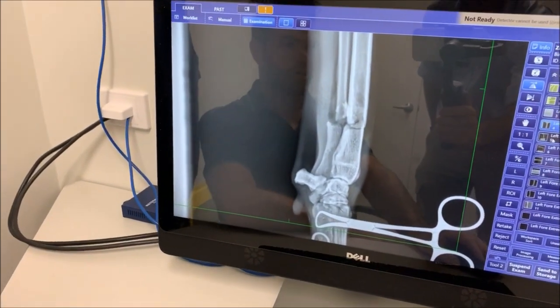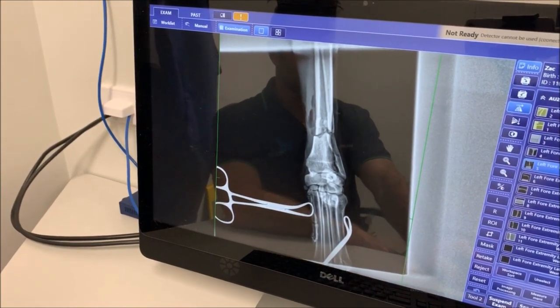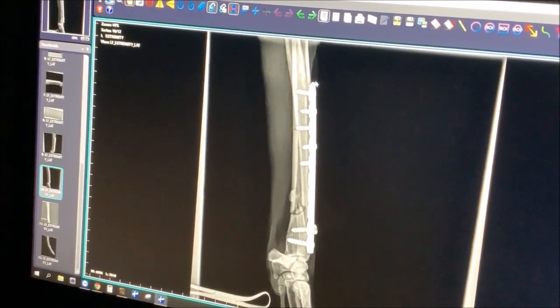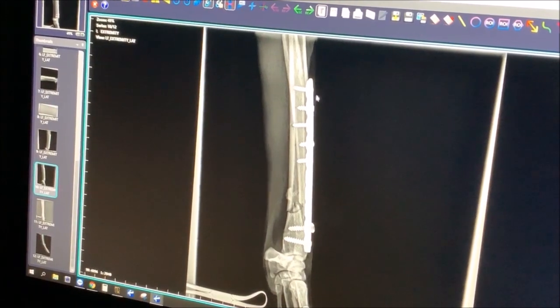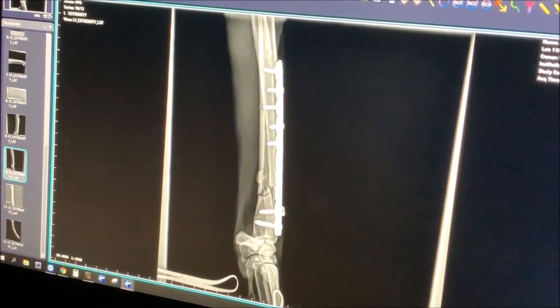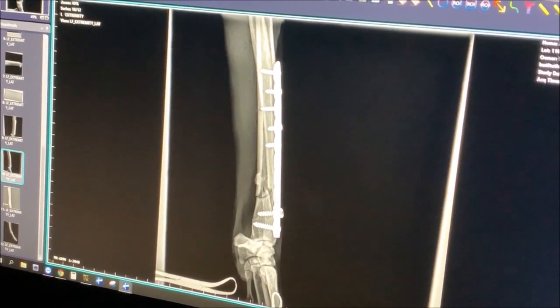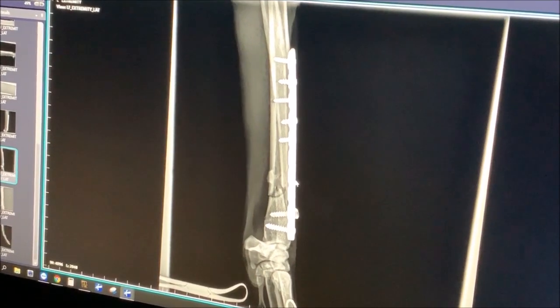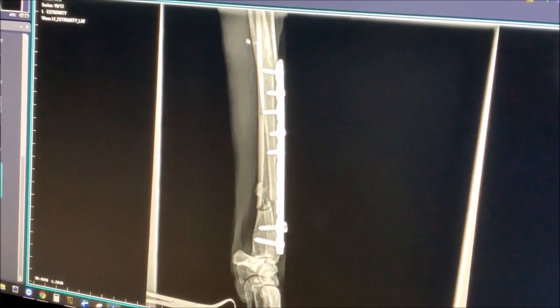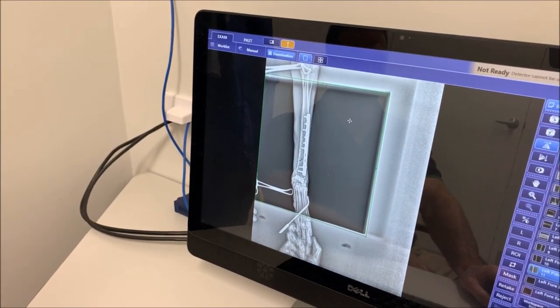During surgery we initially repositioned the leg with x-ray guidance — the front view shows the bones are quite well aligned. We then repaired the fracture using a special limited contact dynamic compression plate, which has notches in it, and we used a variety of screws to keep it all in place. As you can see, the bone looks very well aligned — you can still see the fracture line, but it's much better positioned than before. This is a very solid stabilization and I'm extremely happy with how it's all gone. After this, we placed him in a bandage cast.